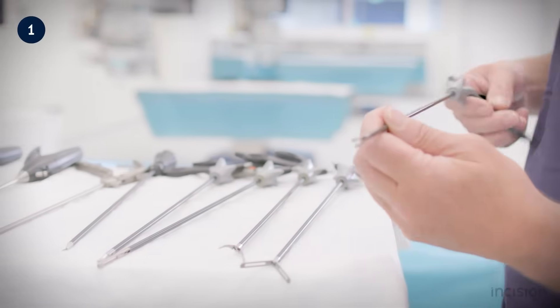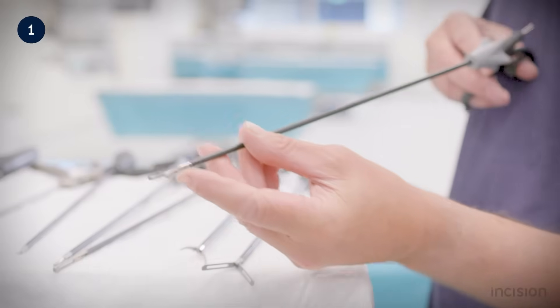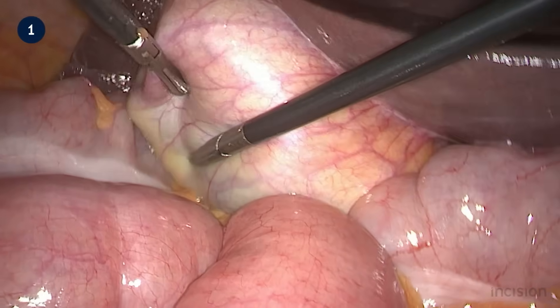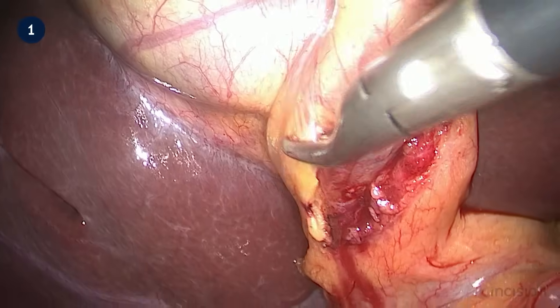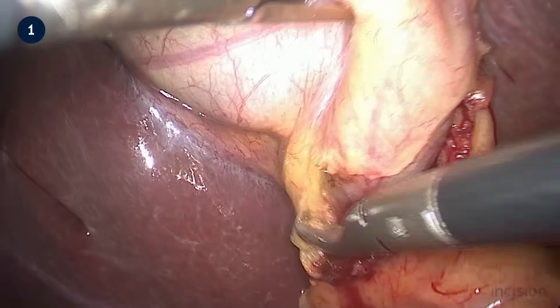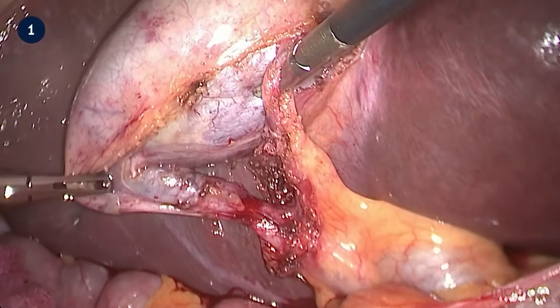A minimally invasive approach is now the gold standard for many different procedures, with core laparoscopic techniques forming the basis for surgical training programs across specialties.